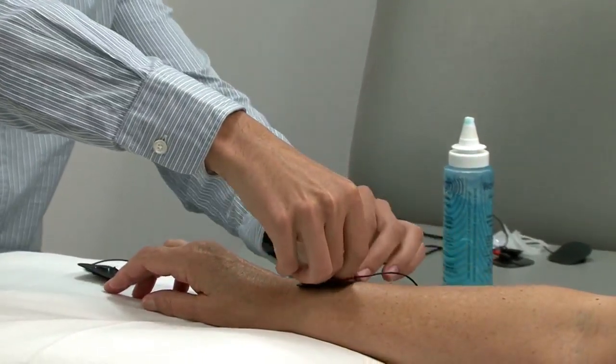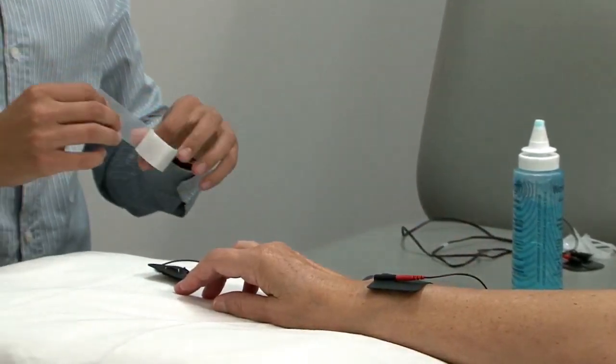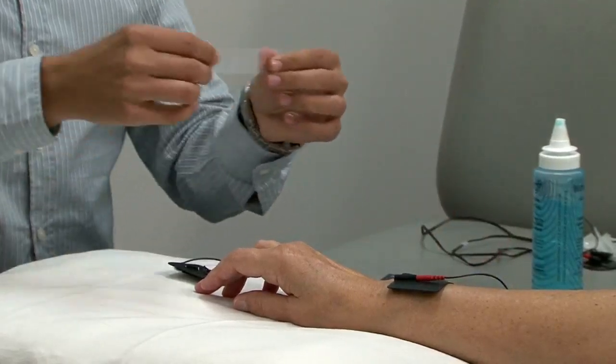Place the electrode like so, and then hold it down with the tape.